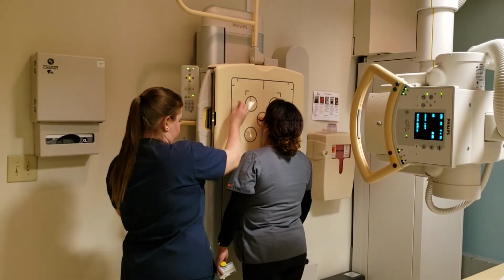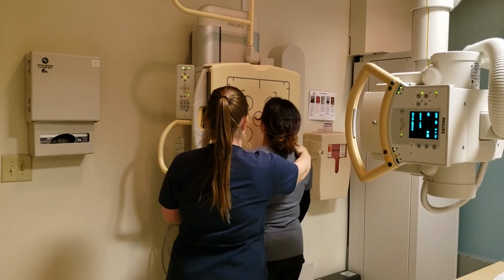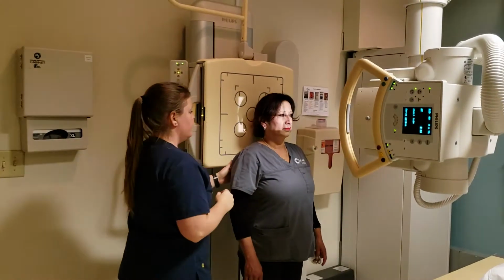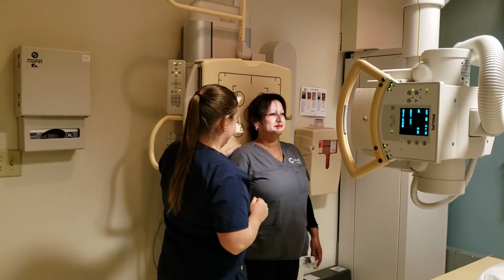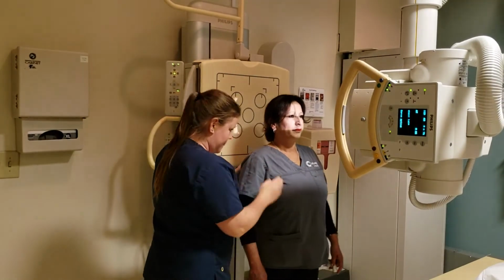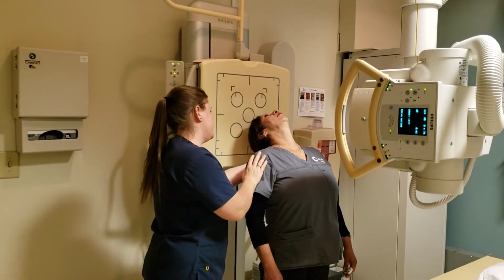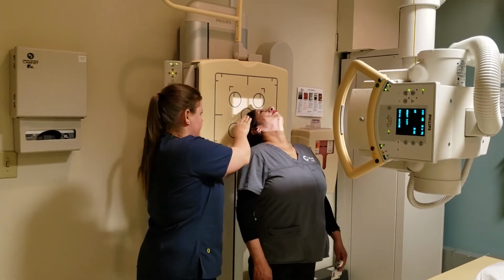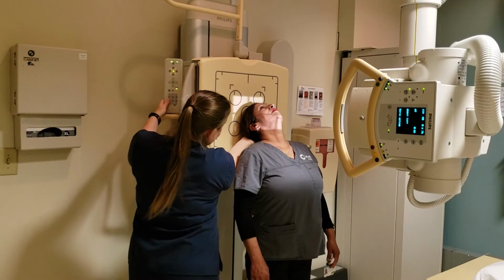And the last one I'm going to do is the SMV, so I'll have you turn around and put your back up against the board. Sorry, have you take a little step forward. And then for this one, you're going to put your head back against the board. Yeah. So, take a tiny step back. Yep. So head is back up against the board. I'm going to move this down a little.